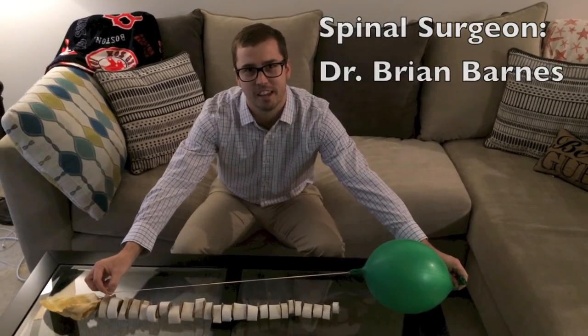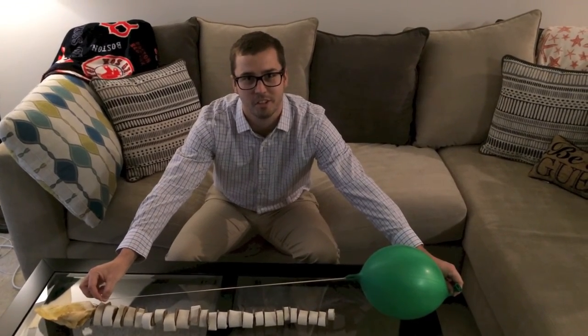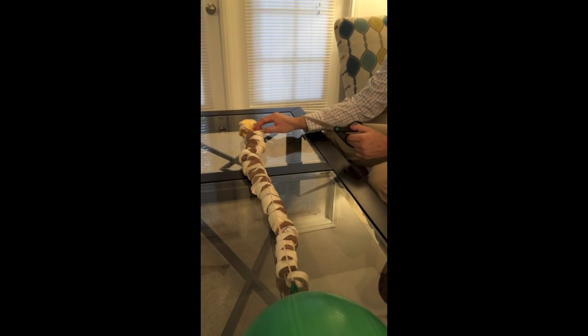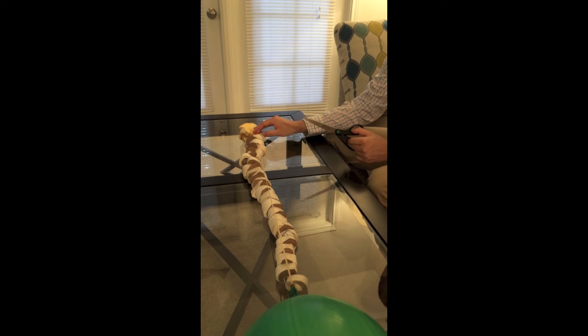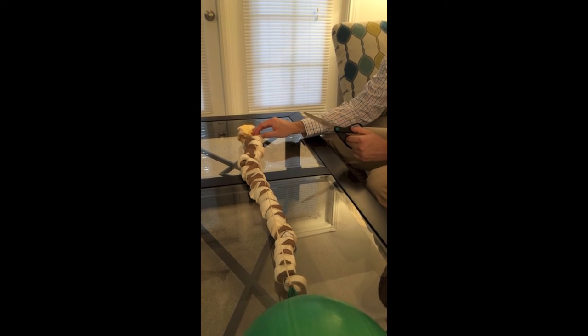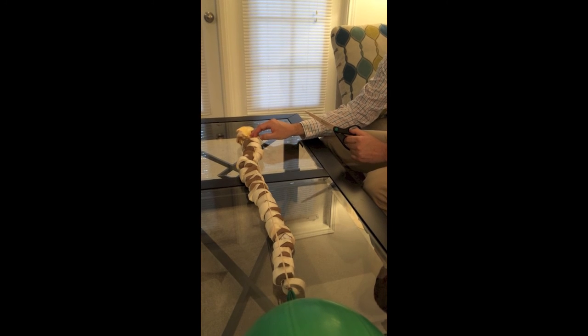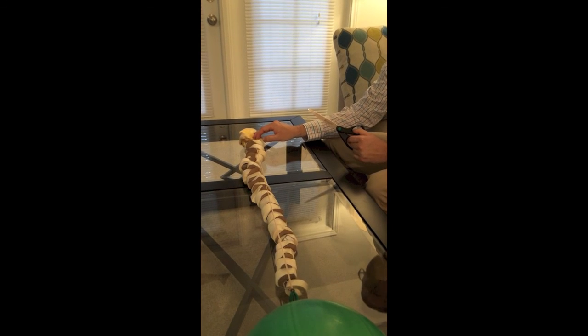Now let's turn things over to Dr. Barnes, who will demonstrate what occurs during a tethered spinal cord surgery. As you can see here, the spinal cord is tethered and pinned down all the way at the end of the vertebral column. During surgery, we go in with our micro scissors between the vertebral bones and cut the end of the filum terminalis, which is a delicate filament near the tailbone. Once this occurs, the spinal cord can properly ride free, as is demonstrated in this example.